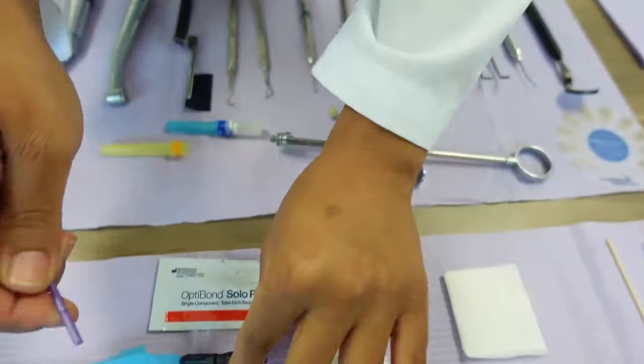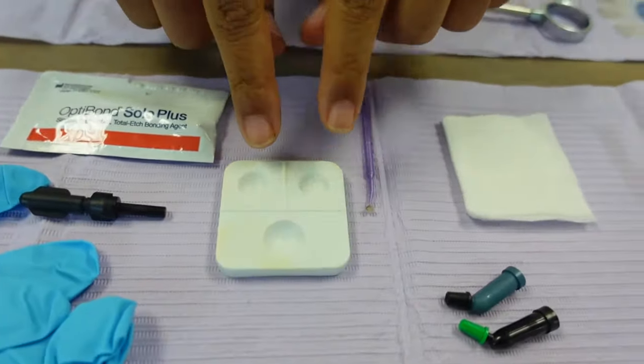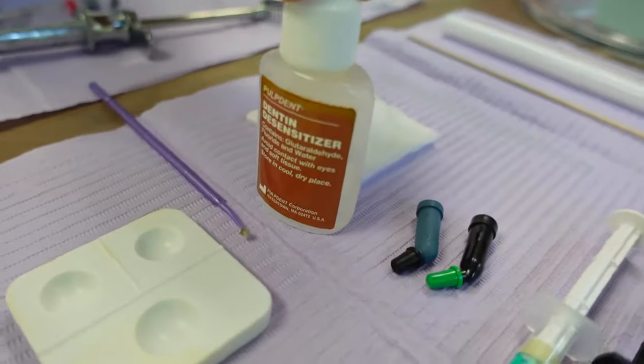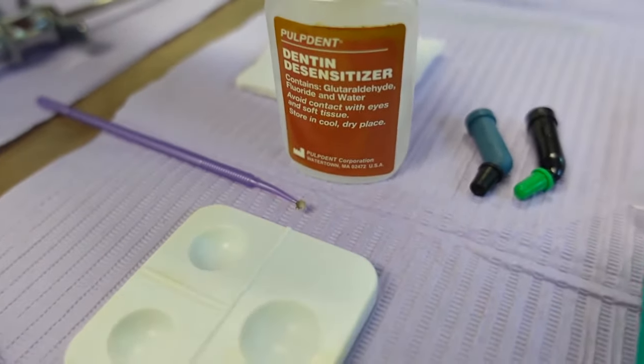Now this well is for when we use the desensitizer, which is sometimes used to line the pulp so the patient won't have that much sensitivity after the filling is done, especially composite fillings.